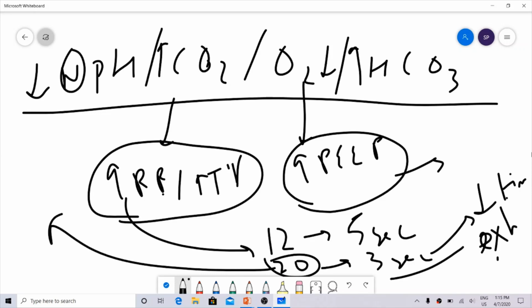Eventually, what will happen if you do this? This will eventually lead to breath stacking. And you all know what breath stacking does? It's actually pretty bad. So basically, you never ever increase the respiratory rate. Now I'll discuss a few more features present on a ventilator which are used in these conditions.